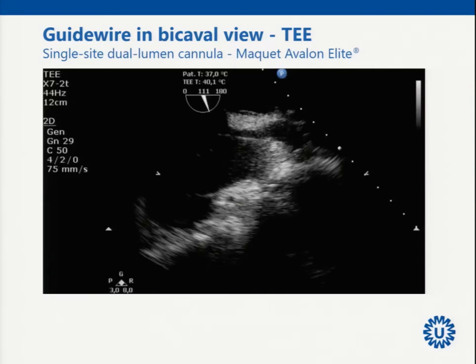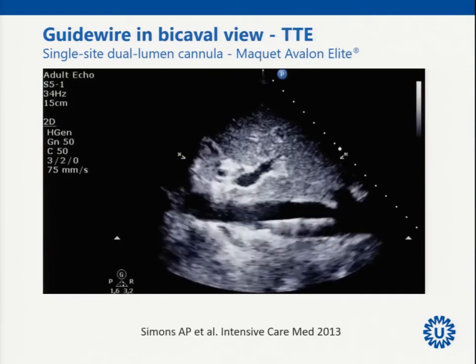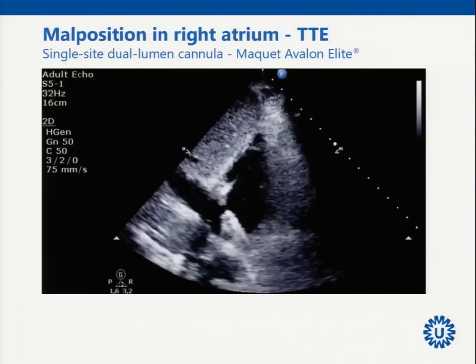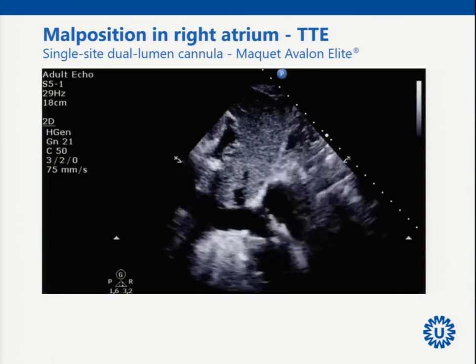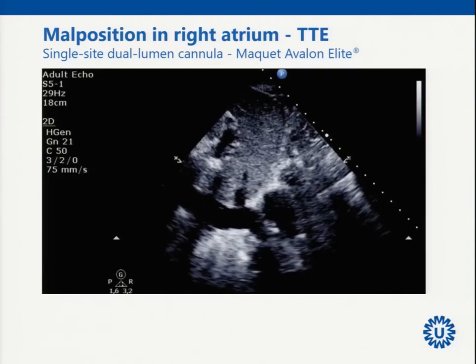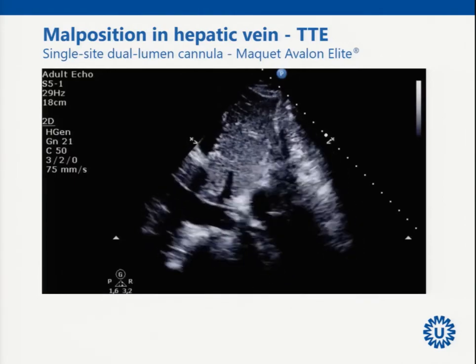You need echo to confirm the cannula is deep in the inferior caval vein and to know the exact dimensions from the infusion hole to the end of the cannula. We start the procedure with the bicaval view. Here: the guide wire going into the right ventricle — not good. The desired position is guide wire within the inferior caval vein. In a very tall patient you may not reach there and instead end up in a hepatic vein, since that is the straight line.